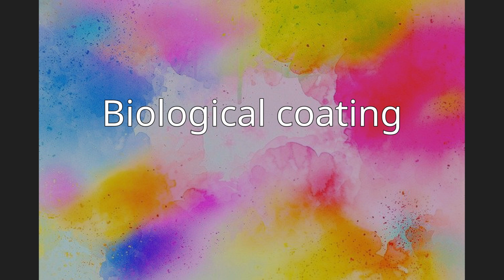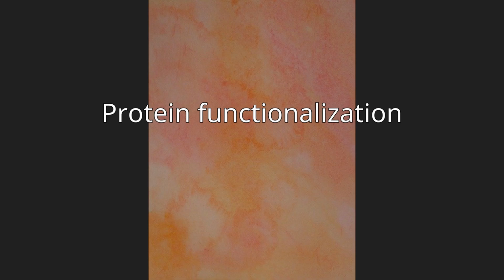33-34. Coating electrodes with a conductive polymer film to improve electrical characteristics, overcoming the encapsulation barrier by increasing electrode sensitivity. 35. Protein functionalization. Another body of research dedicated to improving the biocompatibility of electrodes focuses on functionalizing the electrode surface with relevant protein sequences. Studies have demonstrated that surfaces functionalized with sequences taken from adhesive peptides will decrease cellular motility and support higher neuronal populations.